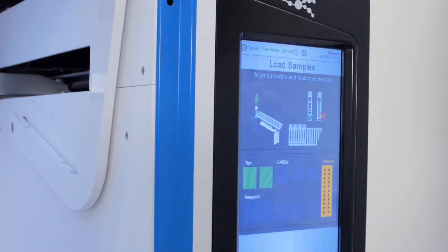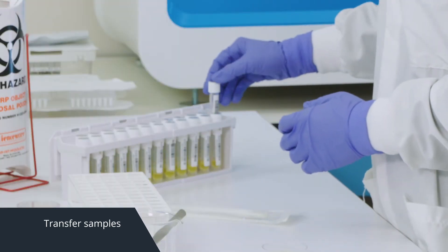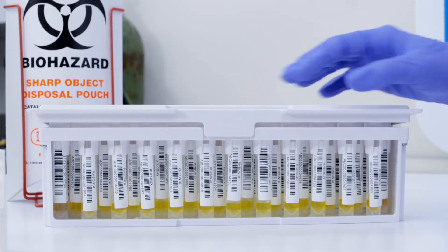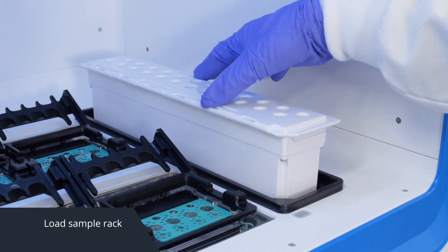No technical training is required to run the Encompass Optimum. The workstation will guide you through each step. Simply transfer your samples and load them into the Rheonix sample rack. The sample tubes are barcoded and scanned internally for increased traceability. Select the assay you wish to run.